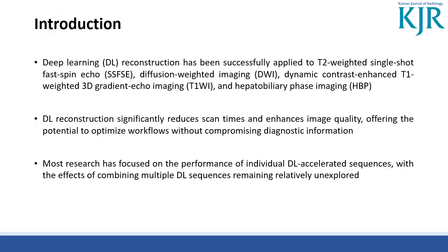Deep learning reconstruction has been successfully applied to multiple sequences of liver MRI. Deep learning reconstruction significantly reduces scan times and enhances image quality, offering the potential to optimize workflows without compromising diagnostic information. However, most research has focused on the performance of individual sequences, with the effects of combining multiple deep learning sequences remaining relatively unexplored.